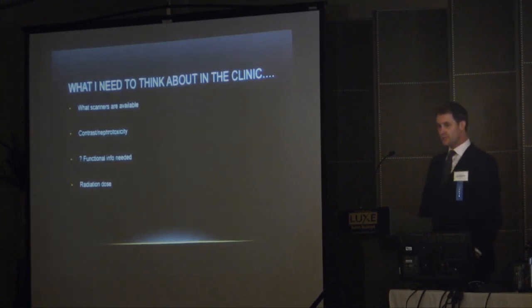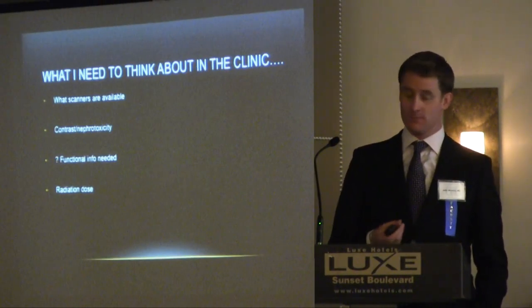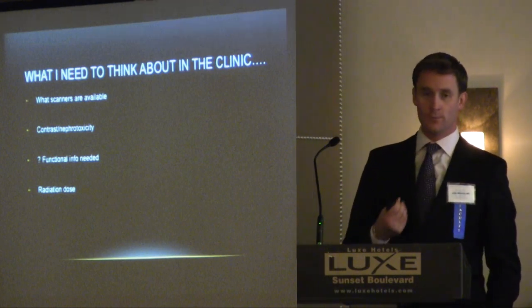I think it's important to know what scanners are available. All CTs are not the same. If you are in a high throughput center, like a tertiary referral center that has good scanners and a good cardiovascular radiology section, yes, absolutely. If you're somewhere out in the boonies where maybe you don't have that, I think you can be left with poor quality imaging that is going to be really of no use to anybody. Contrast nephropathy is the exact same as with catheter angiograms. I'm not going to talk too much about it. Functional information: the next horizon on CT is going to be perfusion imaging, dynamic imaging, where we're able to give you very similar info to what you'd get off an MRI.